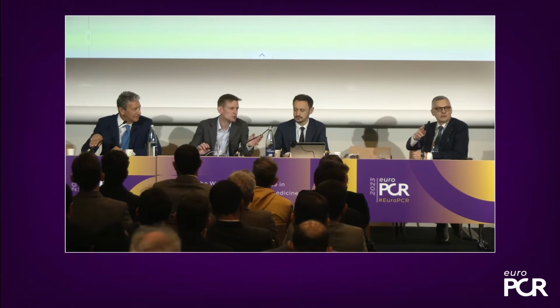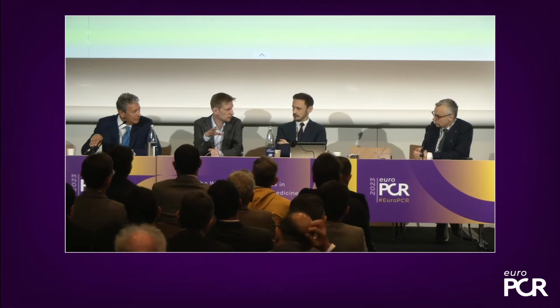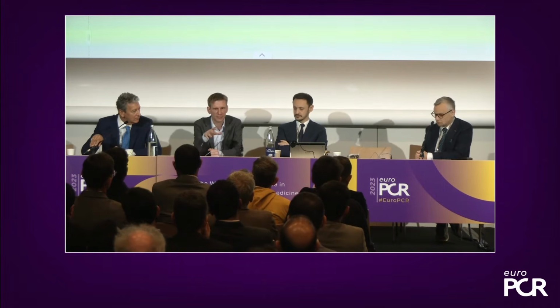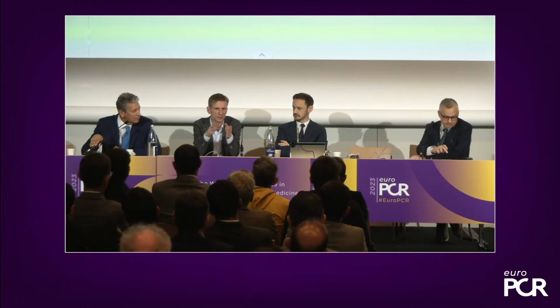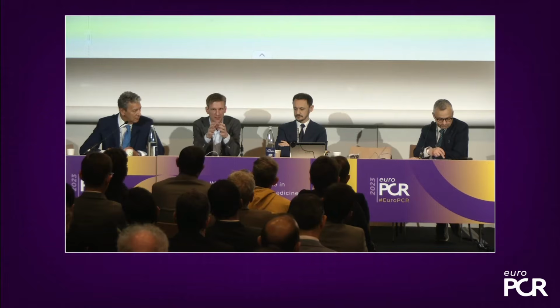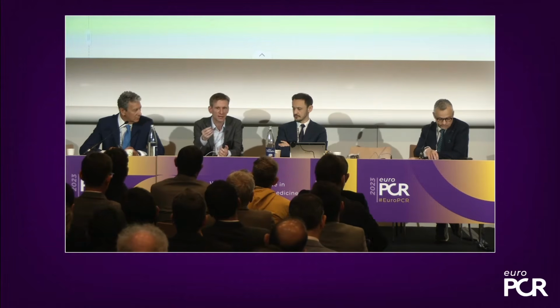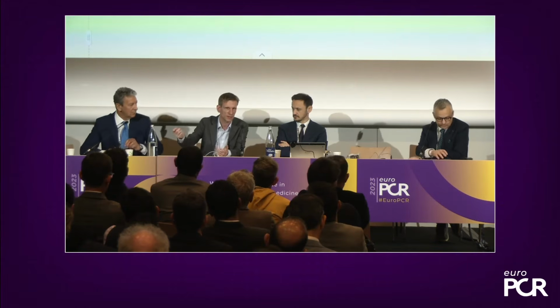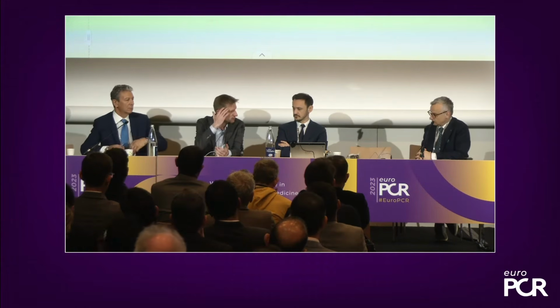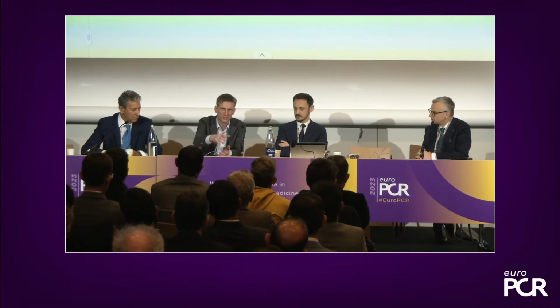Yeah. Look, also, if you do this as a starter, I think it's not forbidden to give a second of fluoro. What can really help, because the whole complexity is to puncture at the correct height. So what is sometimes helpful if you're a little bit lost, or it's an obese patient, is to take a metal object, metal forceps or something, and you know from your pre-CT planning that you want to puncture right at mid-femoral head. Just place that object there and test. It costs you 1 second of fluoro, and sometimes you're surprised.